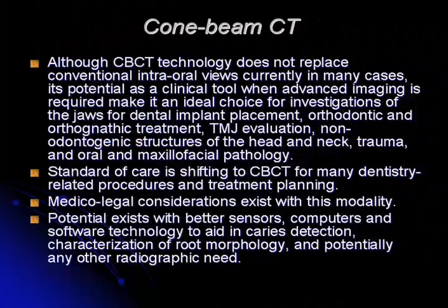So when these scans are taken, there's actually a lot of resources available to you, and one of them is that you can actually have these scans evaluated by a pathologist and a radiologist, and they can give you a path report. So they can do a radiographic pathology report for you and look at the entire volume so that you can focus on your implants, and they can tell you whether there's anything else, any other disease or pathology or anything you should be concerned about with these lesions. And if you think of that as far as standard of care and medical legal considerations, having a pathology report in your hand to put that in the chart and for the patient is very nice. That's going to become the standard of care for medical legal reasons.